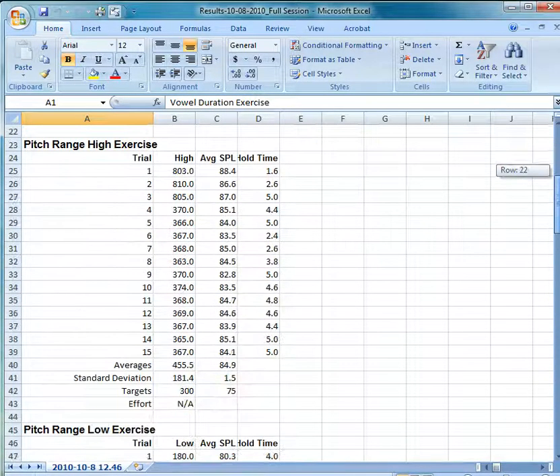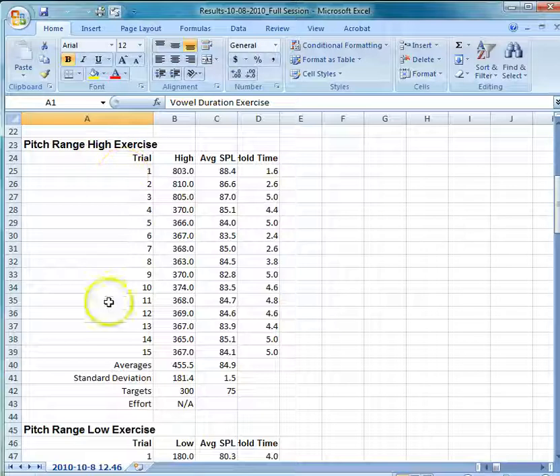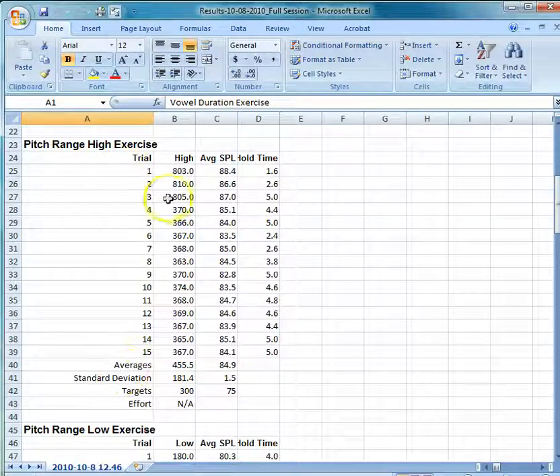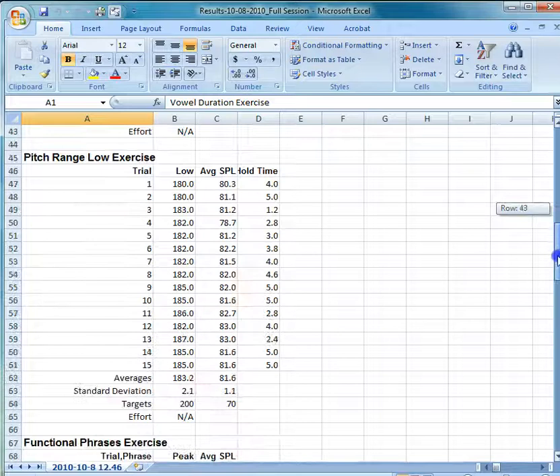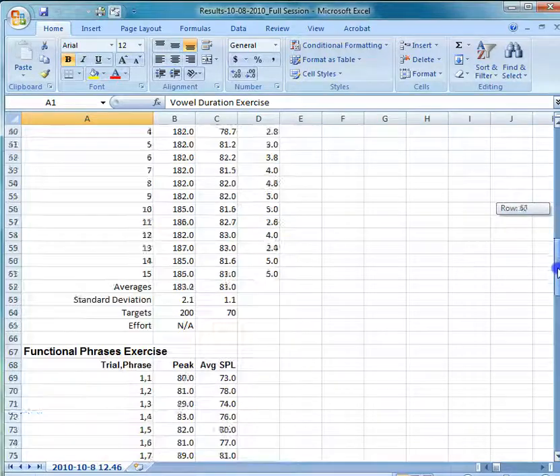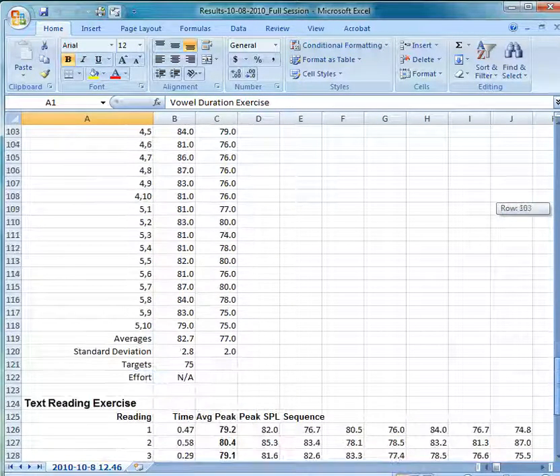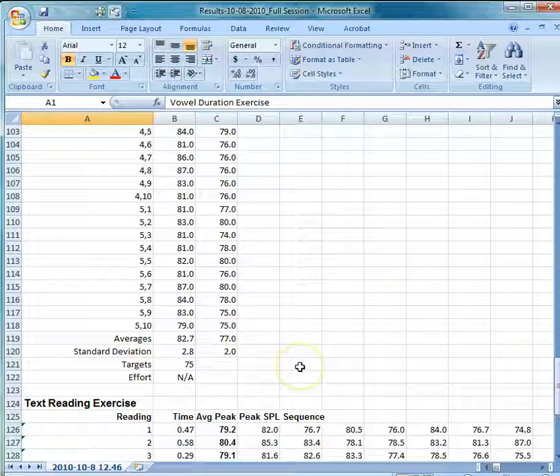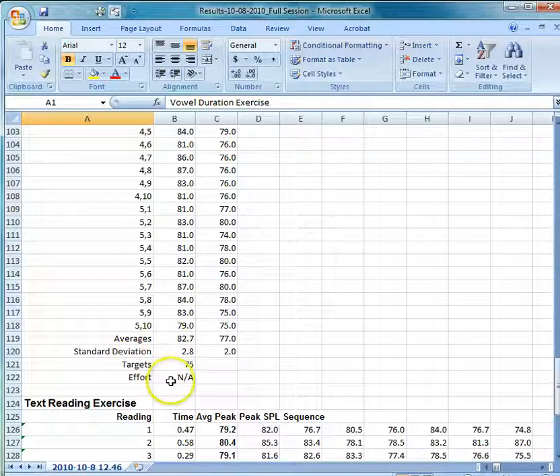If we scroll down, we see the same for the pitch range exercise — 15 trials, the highest pitch, average sound pressure level. We have our low pitch exercise, functional phrases, and at the bottom of the five trials of the functional phrases, you'll see that the average SPL, or loudness, was 82.7 decibels.